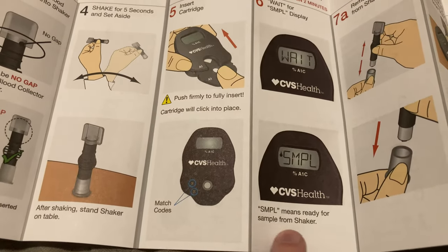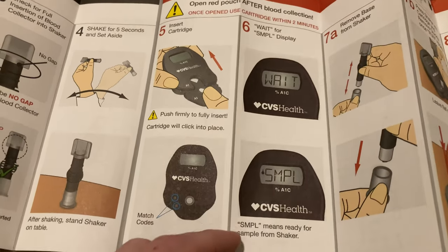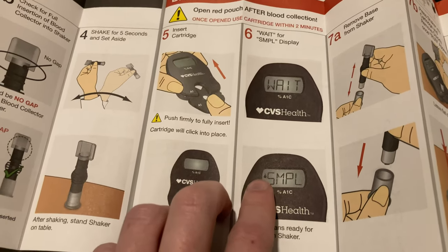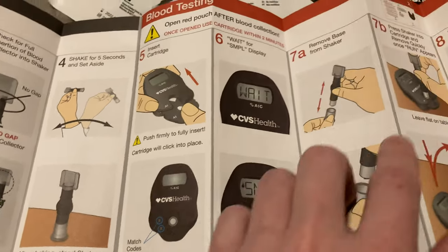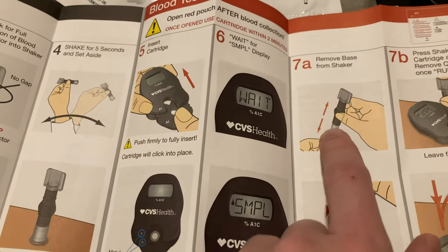Sample means it's ready for the sample from the shaker. Okay, so it's going to tell you when it's ready. So wait means the machine's warming up, and then sample means, and they even put a little blood droplet indicator there, it's time to apply from the shaker. All right, now remove the base from the shaker.